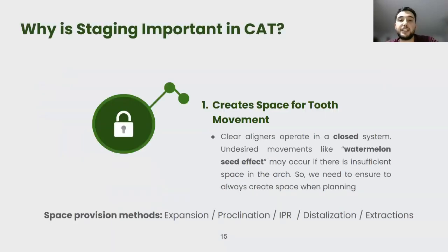So why is staging important in clear aligner therapy? We have multiple reasons. First, it creates space for tooth movement. Clear aligners operate in a closed system. Any undesired movement, like the watermelon seed effect, may occur if there is no sufficient place in the arch.